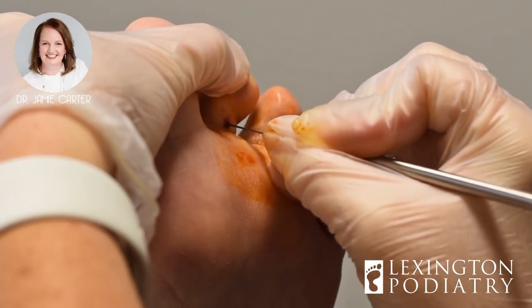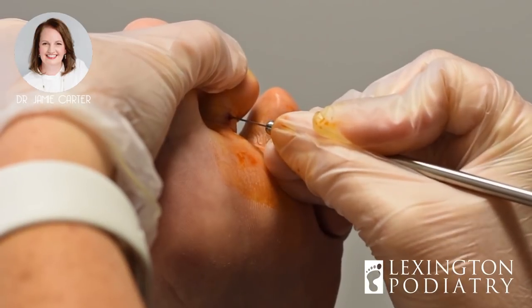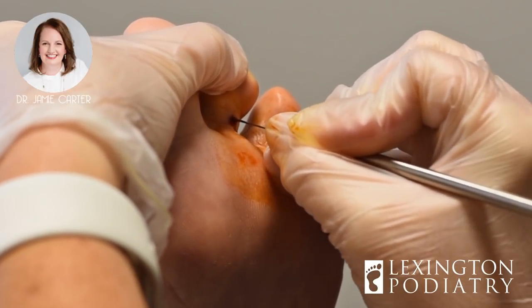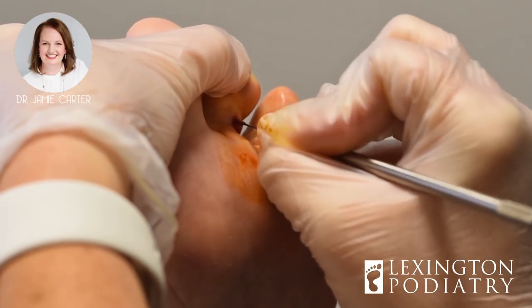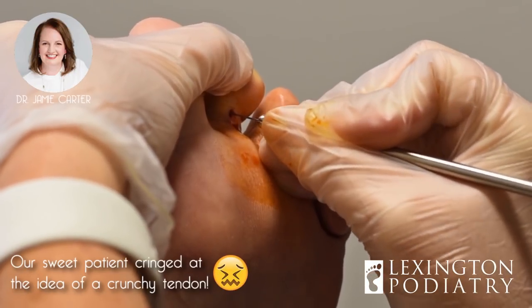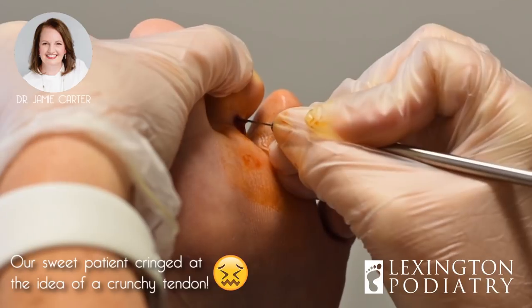Oh, I felt the toe release — oh my goodness. So all the soft tissue into the joint kind of sounds like celery crunching. That's what I've given you — all kinds of good information today. She's gonna be like, I quit.